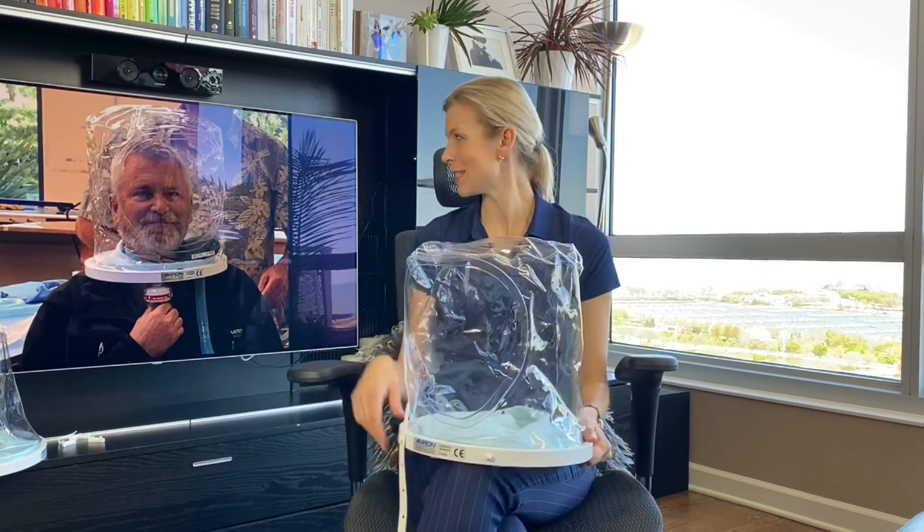I had a chance to talk with Scott Ritchie. He's a VP of Engineering and Manufacturing at Amron International, and you can see his picture here behind me with the helmet. He told me about the newest features of the helmet, and how it is comfortable for the patients and easy to use for clinicians.